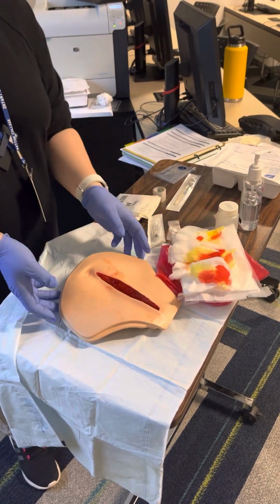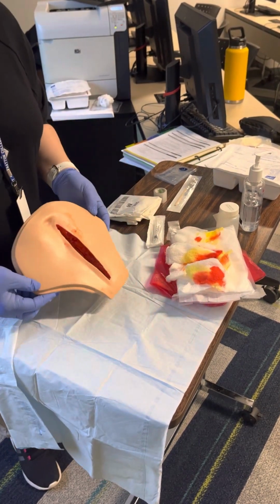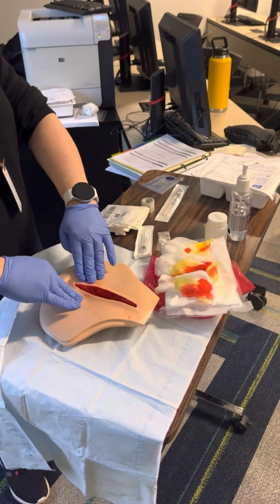All right, now I've gotten to the bottom of the wound. I'm looking on the inside of the wound to see the color. The color of this wound bed is red. I'm gonna assess for edema, so I'm gonna palpate around the outside. I don't feel that this is swollen, so there's no edema.